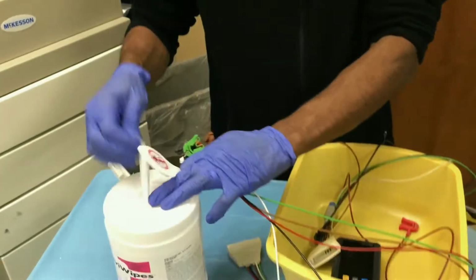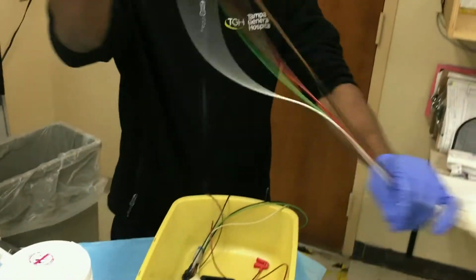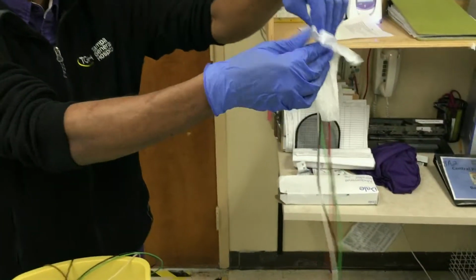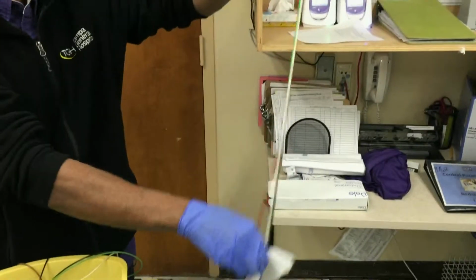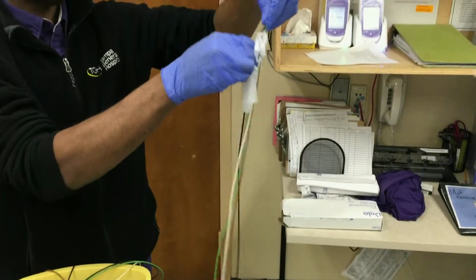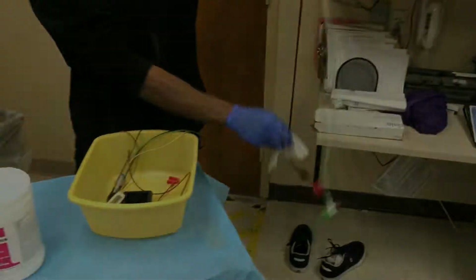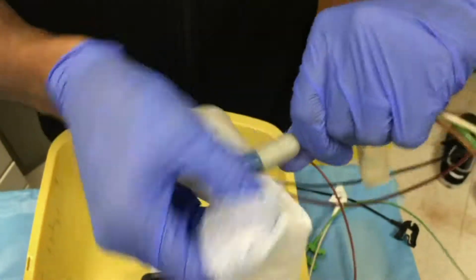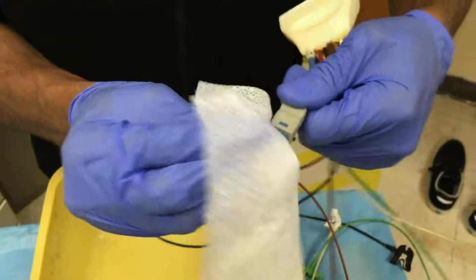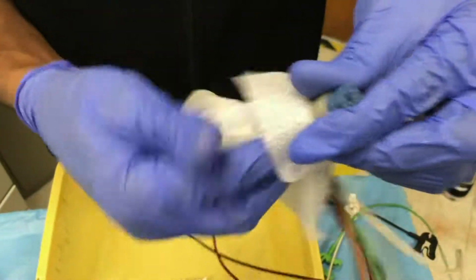Lastly, you want to use a fresh Cavicide wipe to do a final wipe down, ensuring that no residue is left behind. This process is considered a two-step process and aligns with the standards of infection prevention. In addition to cleaning the cords and the connecting piece of the lead set, it is also essential that you give special attention to the SpO2 connecting cord. And there you have it.